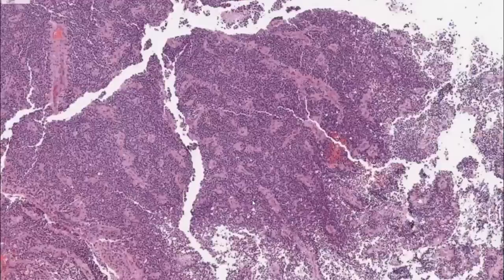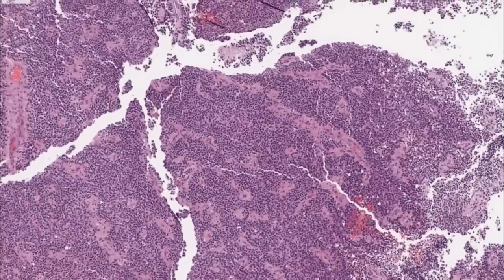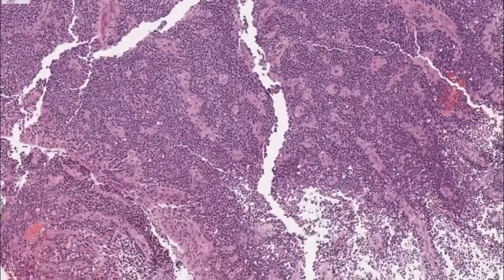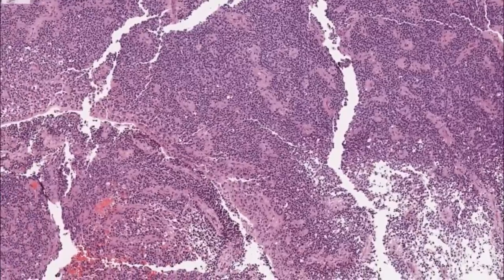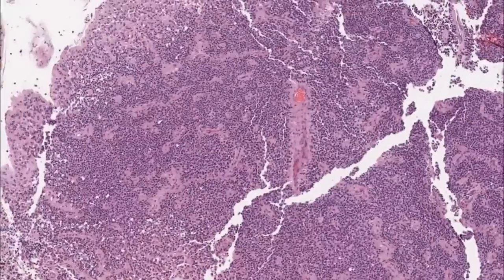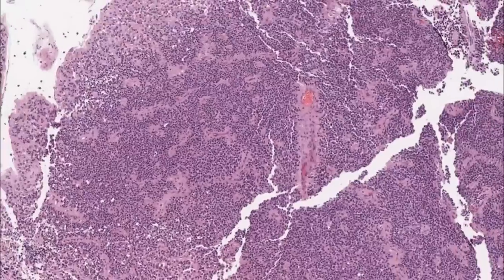And this is a tumor here. And you can see there are pseudorosettes, multiple pseudorosettes everywhere. So certainly ependymoma must be considered. It's very cellular, it's very blue.